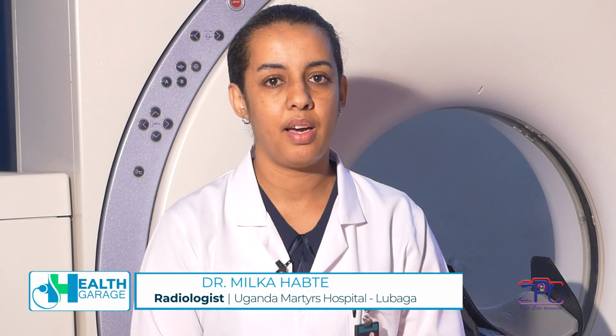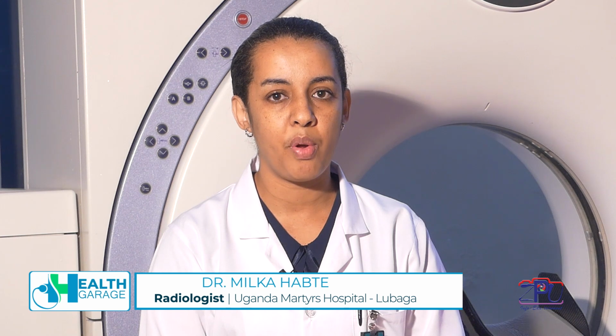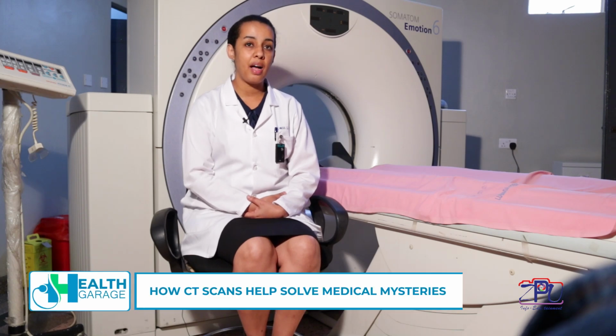When someone goes through a CT scanner, the procedure is not painful. However, we prepare the patients for the circumstances that the patient may experience during the CT scan procedure. It's not painful at all, but as I mentioned earlier, we make sure the patient is not allergic to the dye we use. We make sure the patient is not claustrophobic. We also calm the patient because the patient is going to be in a room most of the time alone, as the technologist watches over him through a window.